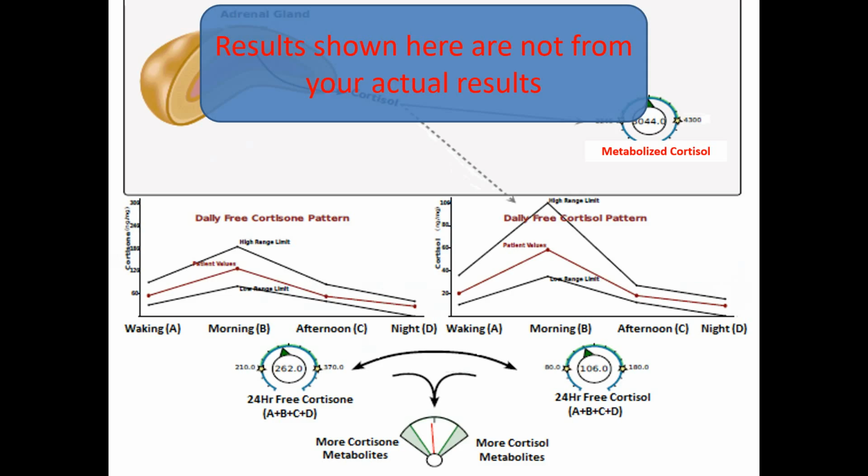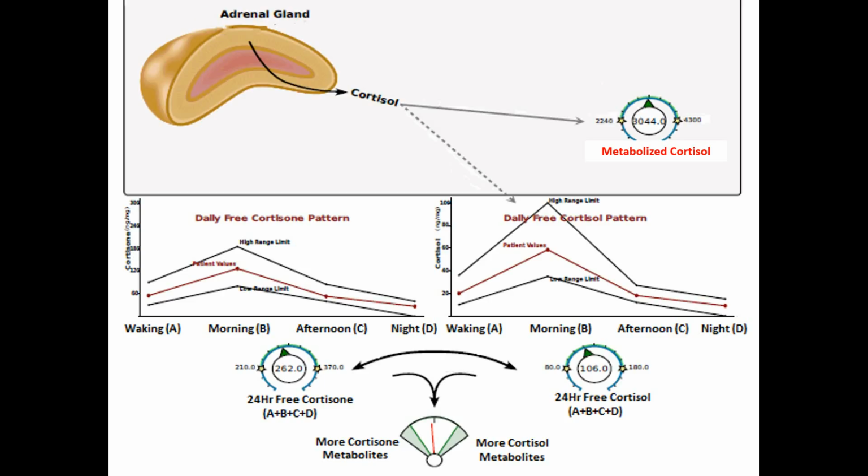We're going to show you an example set of results here and then talk you through a situation that's similar to yours, but there are no results on the screen here that are from an actual patient set of results.